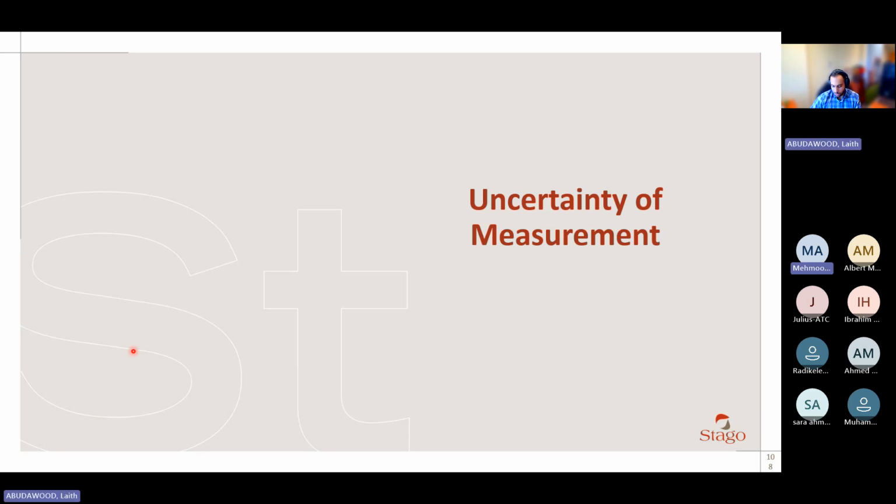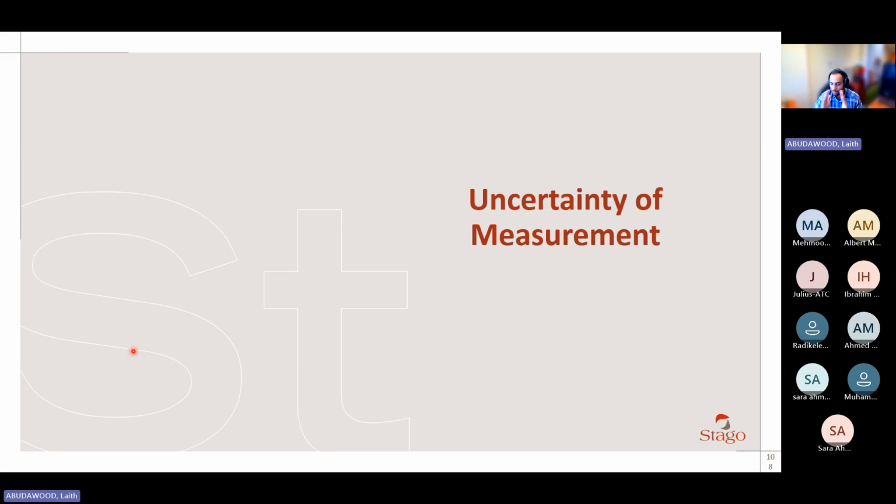Let me give you more details. For protein C and protein S, the most important factor in failure is that reagents are old, or maybe not reconstituted properly, for example, and the machine is very old and not maintained. Now, of course, some machines are in better condition than others. Some machines are less busy than others. And one point that I think would be quite good to follow is try to run protein C and protein S by themselves. When you are running routine, finish your work, dedicate some time to finish protein C and S by themselves. Do not run anything else with them. Then continue the rest of your work.